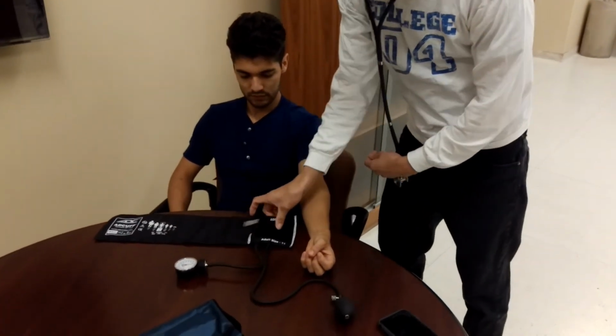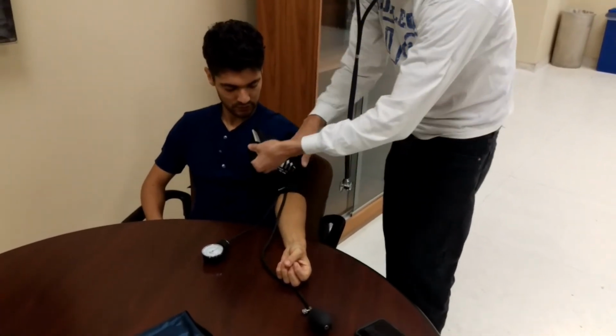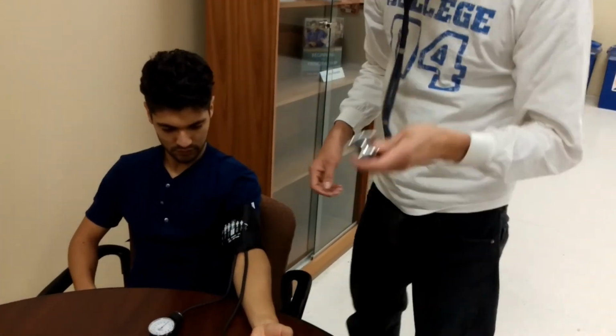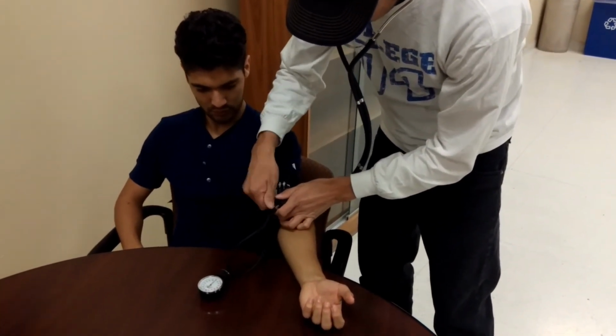Assessment. Make sure stethoscope ear prongs are facing forward. Align the artery mark with the brachial artery. Place the bell of the stethoscope over the brachial artery. Do not place it under the cuff. Turn valve to the right.